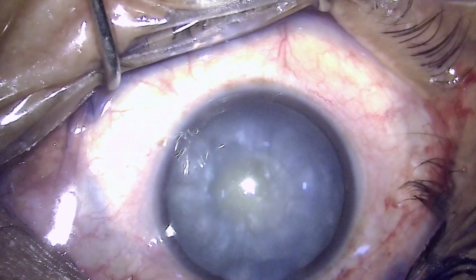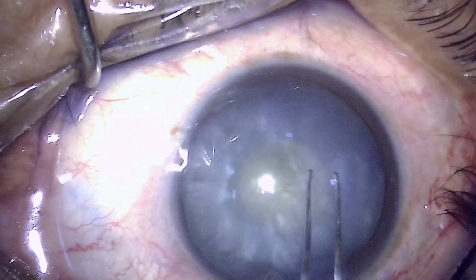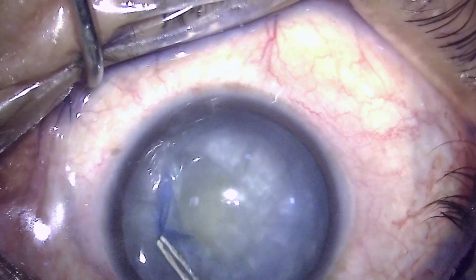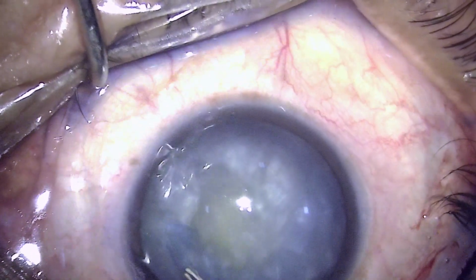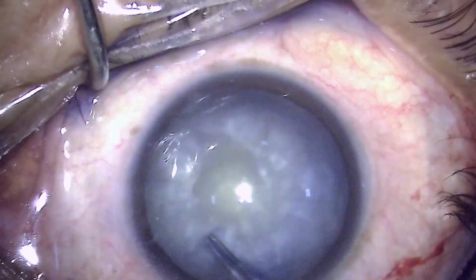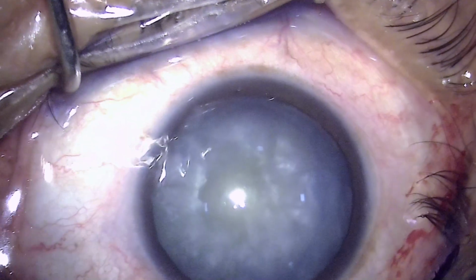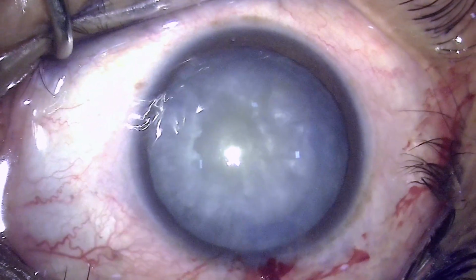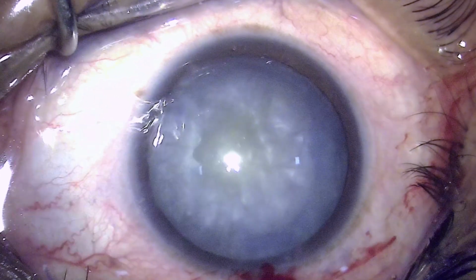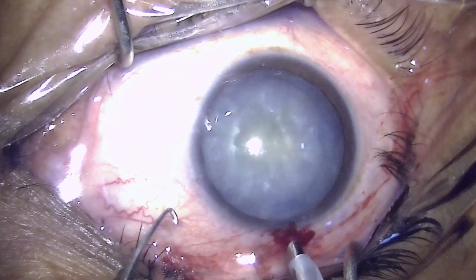This decompression technique can be done before surgery also, and it has been demonstrated that even YAG laser capsulotomy done few minutes or maybe a half an hour before the surgery actually helps in managing this situation. But here I am demonstrating this technique where doing a double rhexis does the same job. So as we can see, this double rhexis or the second rhexis never had any intention to be blown out, and it was a very well controlled rhexis, just like any other cataract.